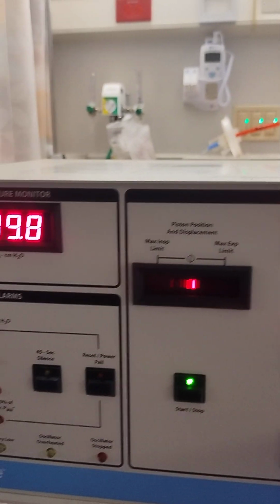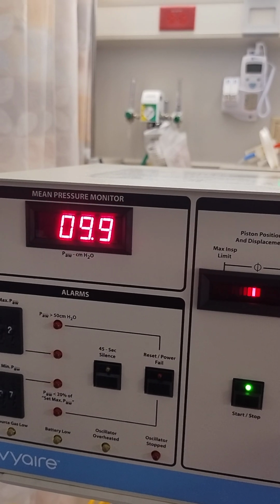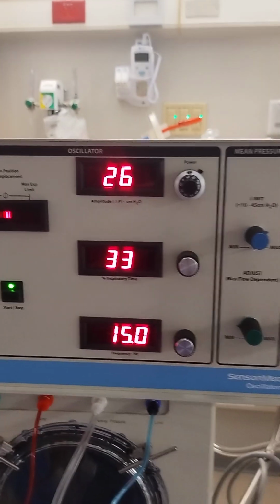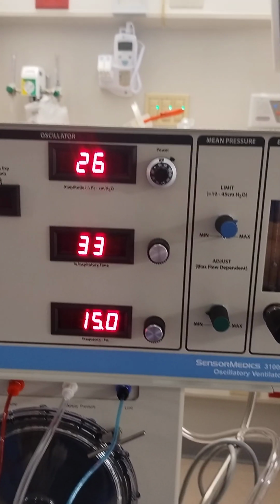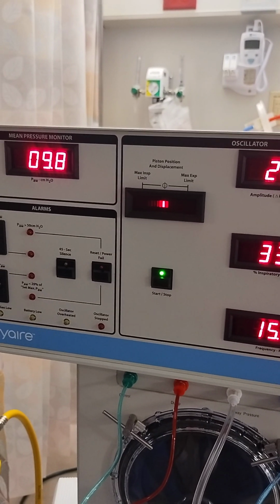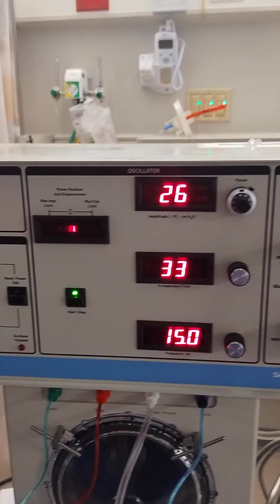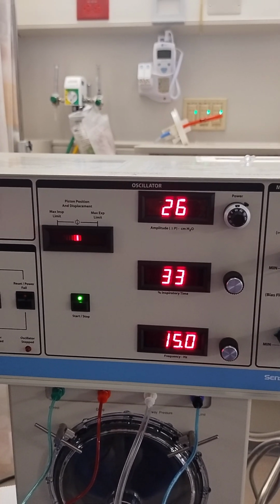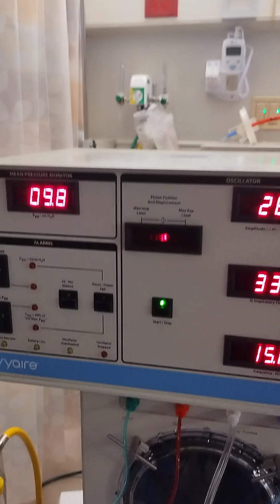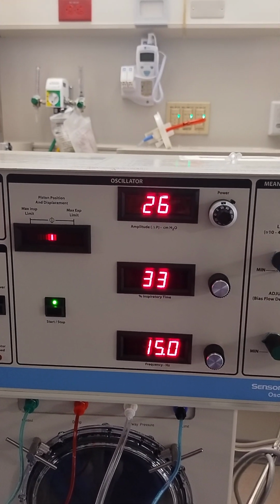And we can make any minute adjustments to our settings so that we maintain the appropriate mean airway pressure for the baby. Now, during the course of their ventilation with the oscillator, if you do need to make adjustments, it's important to make sure that you have provider orders for the appropriate settings that they would like the baby to be placed on. And if you do need to alter the settings, you can change them from here.